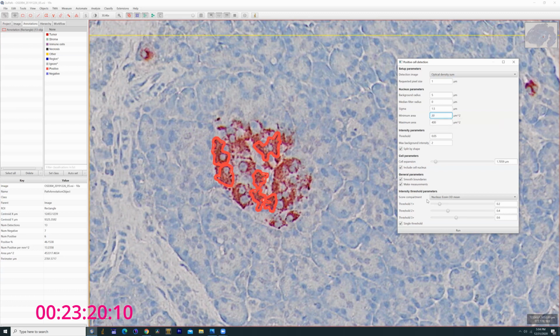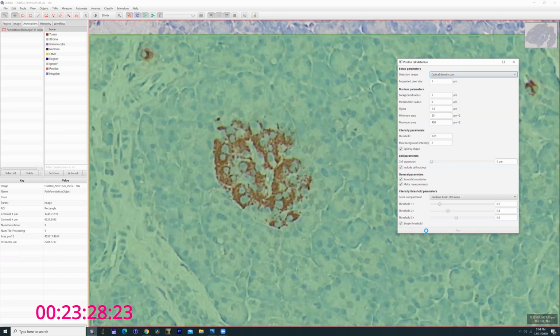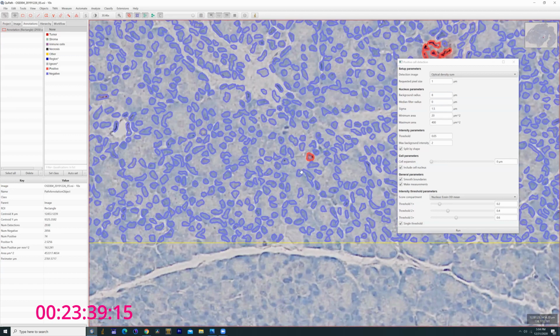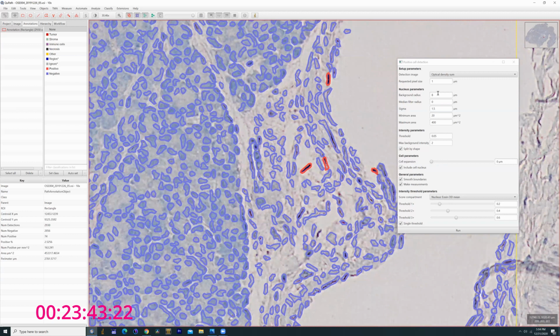But the point is, it's also nice because you can eliminate some of the unintentional background within this. Here, let's try run. So basically what I'm hoping is by setting this at a high enough level, I'm sort of eliminating, and you'll see in a larger one, debris from, say, these internal sections in here.